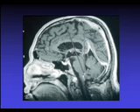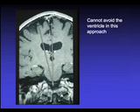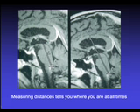Thus, in this patient, we did a coronal approach that traverses the ventricle and then into the thalamus. A trajectory is determined to reach the midpoint of the midbrain, not too anterior, not too posterior, to travel through the pons and to reach the medullary target. Here's the coronal approach, entering that gyrus at the top of the head.